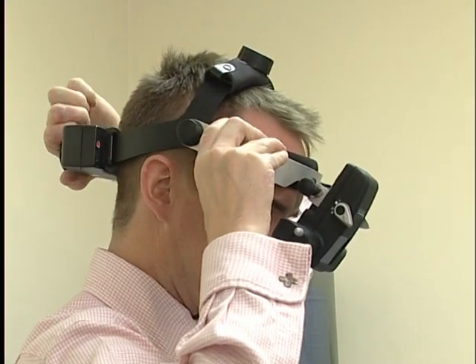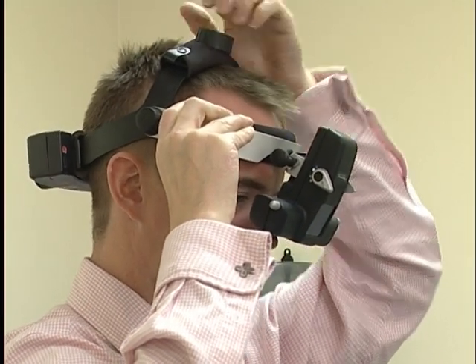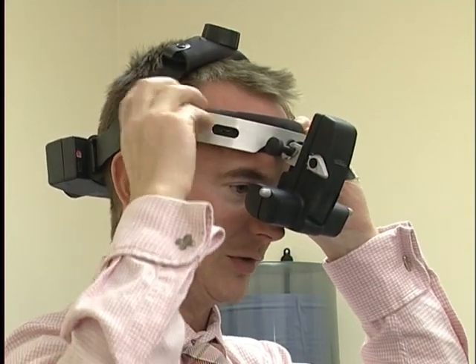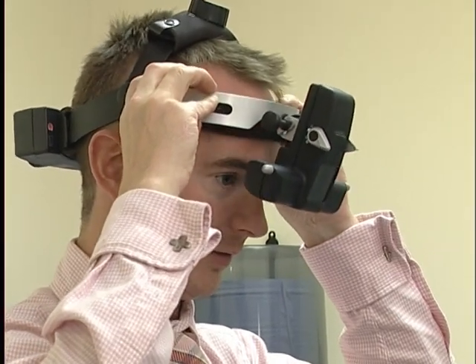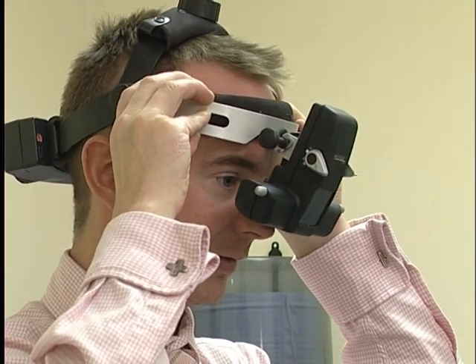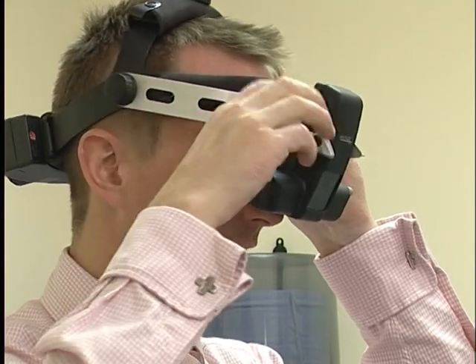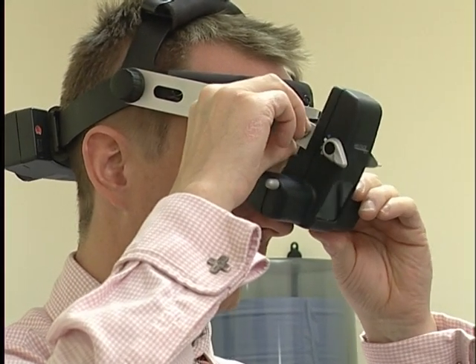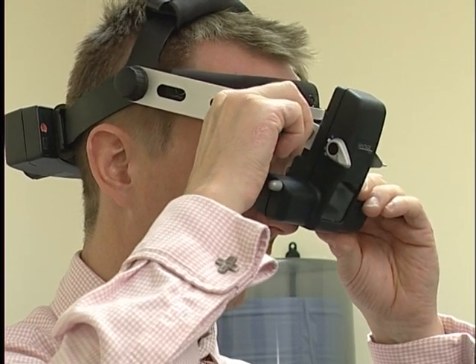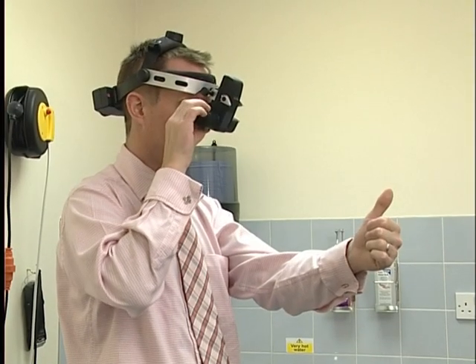In order to set up the indirect ophthalmoscope, adjust the headband so that the instrument is supported comfortably around the top of the head. It's then necessary to set up the ophthalmoscope angle alignment. To alter the vertical angle of the ophthalmoscope head, use the adjustment knob on the side to bring it into alignment with your glasses or your eyes. Place an object, perhaps the thumb, approximately 40 centimetres from the face and centre it horizontally in the light patch. Then close one eye.